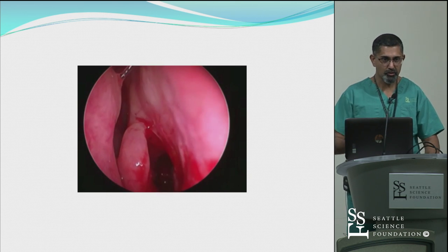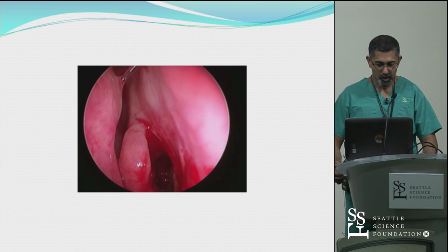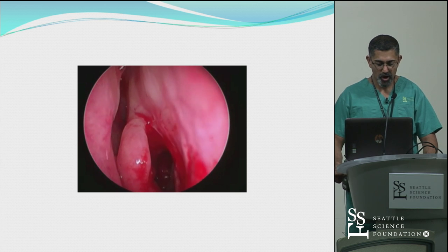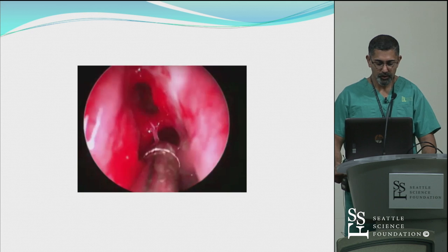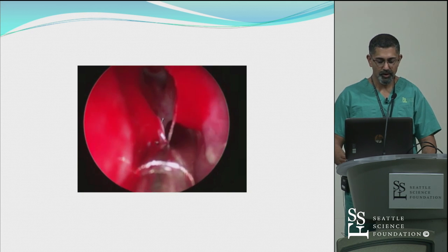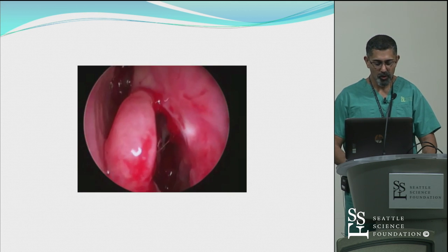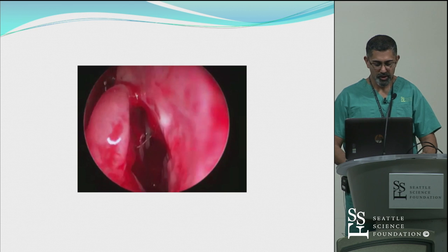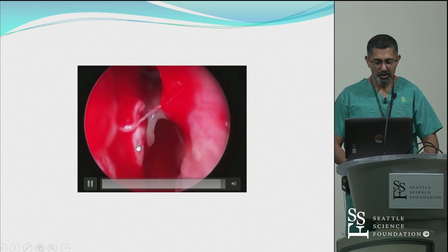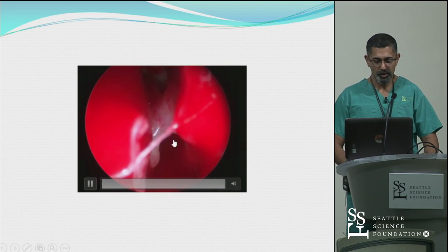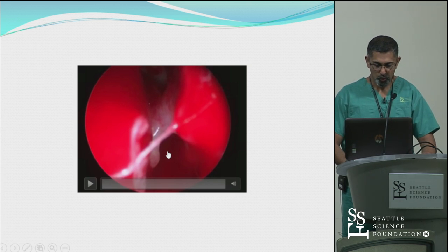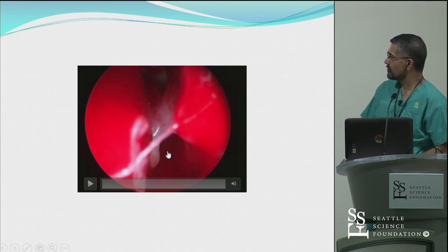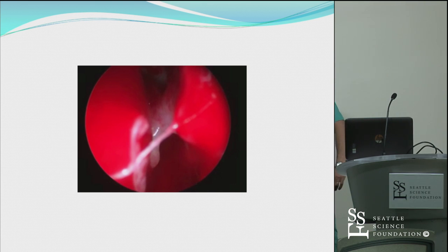A lot of these patients, because they've had FESS before, are pretty accepting of office procedures. After sucking the blood away, you look into that outflow tract and see the difference that's been achieved. One soft point here is that you can see why this frontal was prone to failure, because posterior and lateral to the frontal itself is this supraorbital ethmoid air cell.